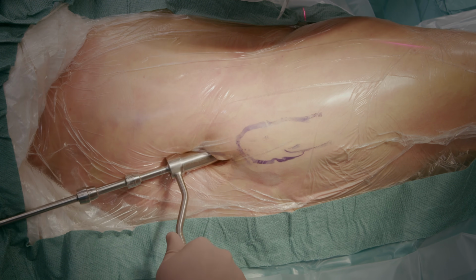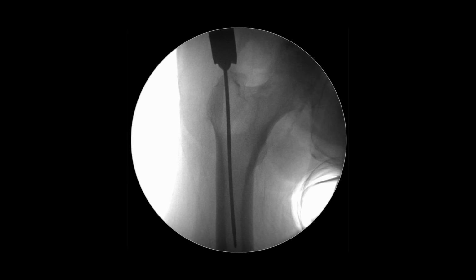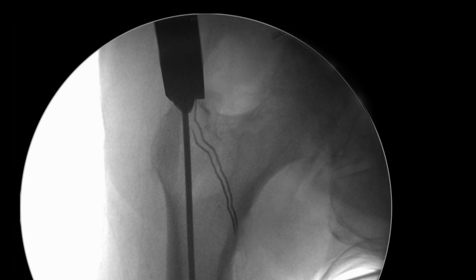First, we check that the reamer is in the right place and take an image. It's important to note that in a trochanteric fracture, the fracture often reaches the tip of the trochanter, and strong pressure should not be applied during reaming. Reaming with substantial pressure may start spreading the fracture fragments apart and dislocate the fracture.